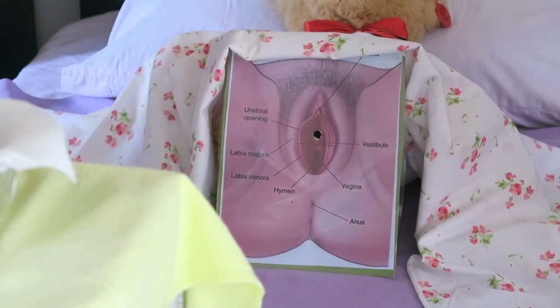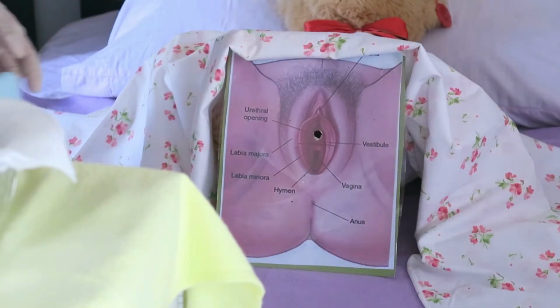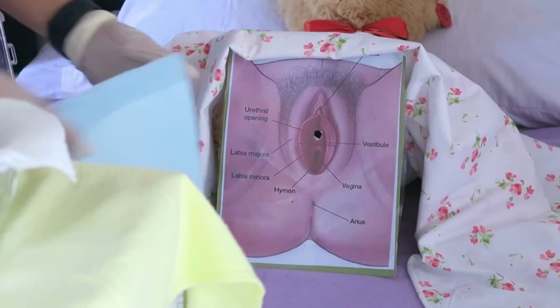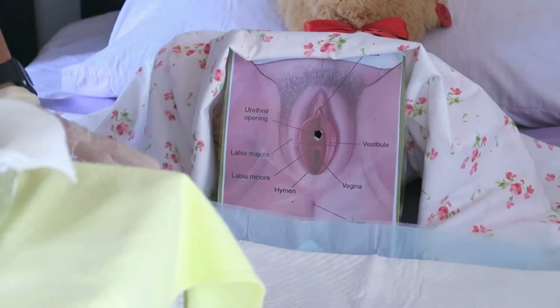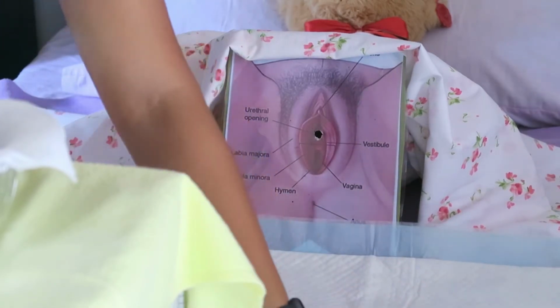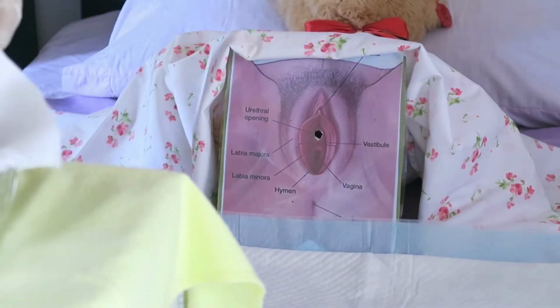After that, put the draw sheet under the buttocks of the patient. Ma'am, I will put the draw sheet under your buttocks po, ha? Okay po, thank you. Then, put the eye sheet.